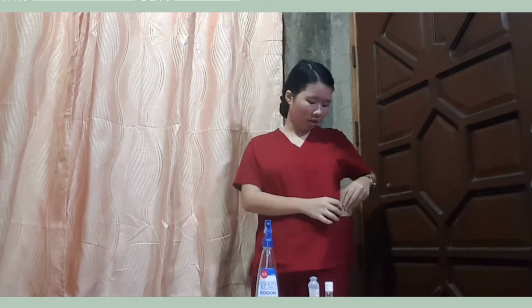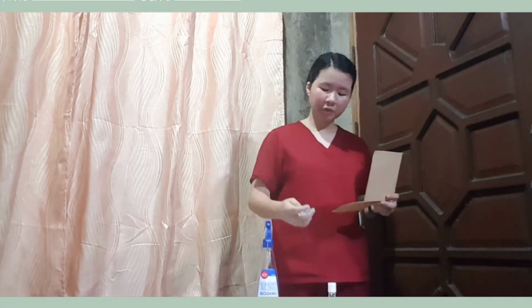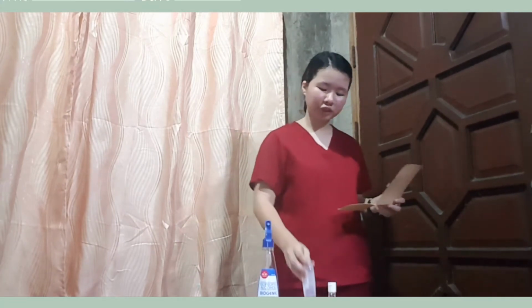We are now going to proceed to procedure number 7. Perform the standing 3 checks of the drug together with the medication ticket. You're going to do this when it is taken from the medication cart, before withdrawing the medication and after withdrawing the medication. By doing this, you check the medication before you administer it to your own patient. So now we're going to check, since we've checked it a while ago after removing it from the cart or the refrigerator.